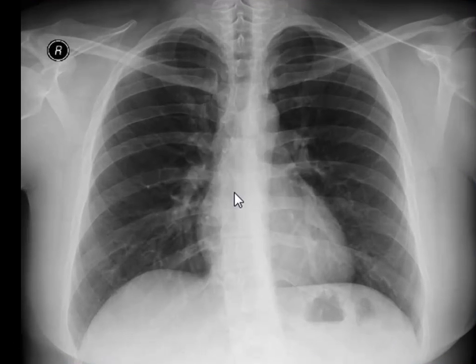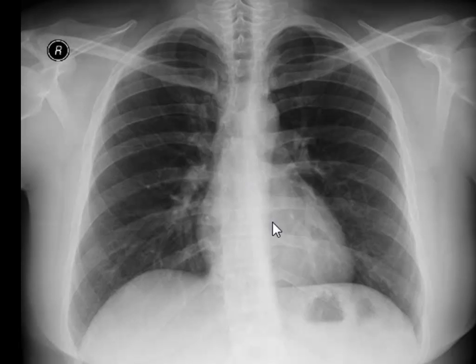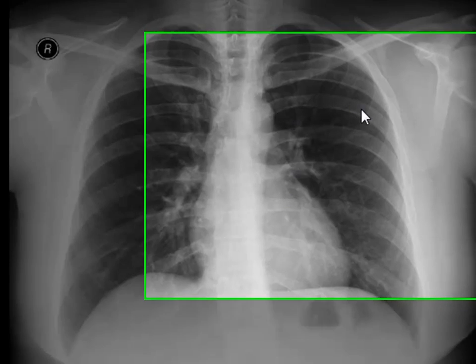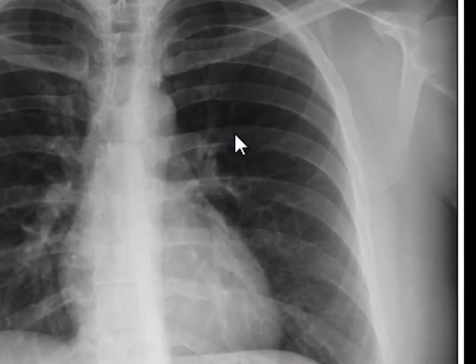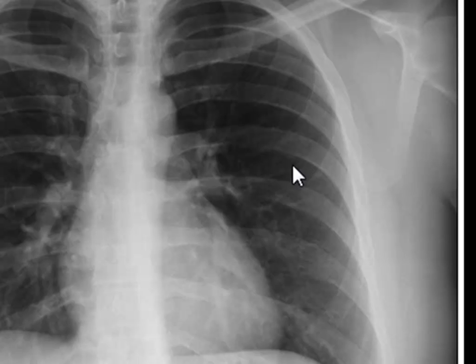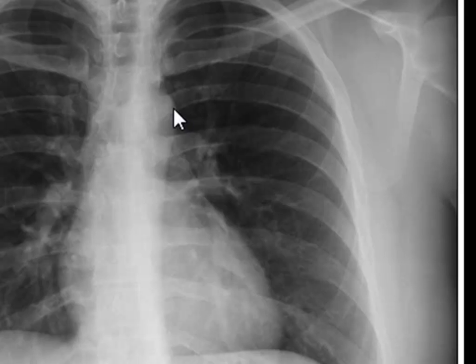We have a normal chest X-ray in front of us, and I want you to pay attention to the orientation of ribs — notice how posterior ribs are visible on a chest X-ray and how anterior ribs are visible on a chest X-ray. These are posterior ribs, all of them. This is a posterior rib, this is a posterior rib, this is a posterior rib.